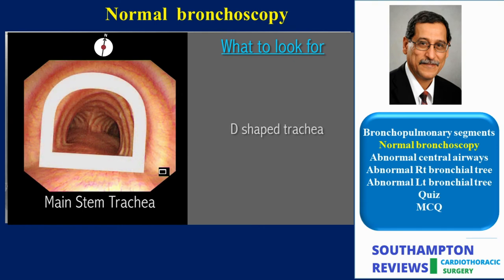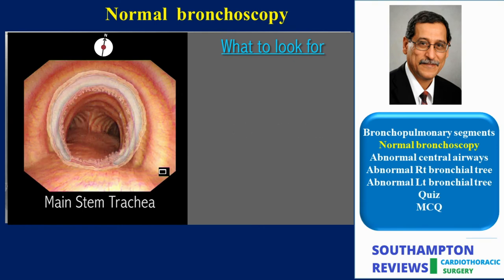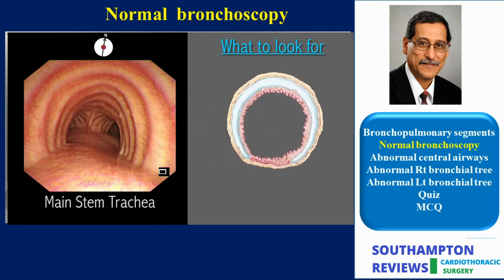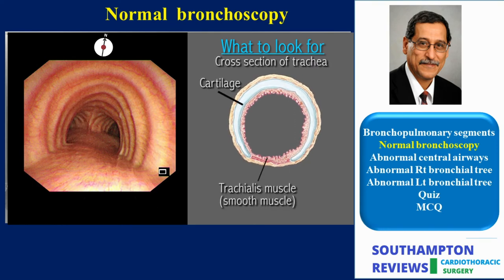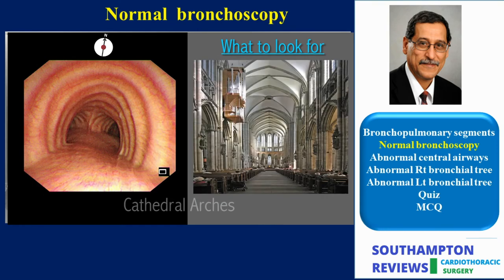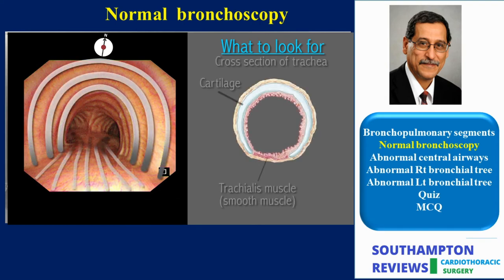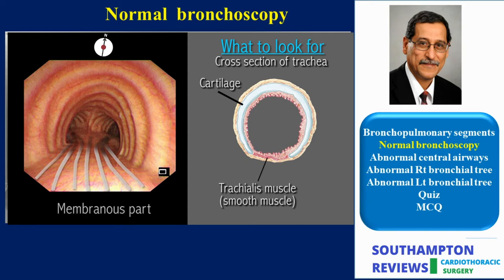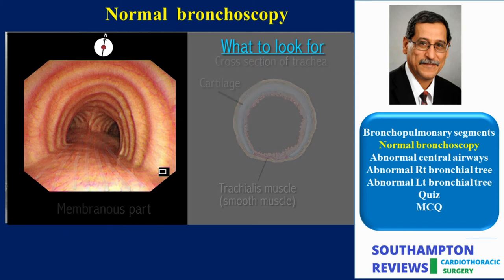The normal trachea has a D-shaped cross-section. The architecture of the scaffolding of the trachea is preserved by the C-shaped cartilages, which form what is known as the cathedral arches. The trachealis muscle forms the membranous part of the trachea and shows as longitudinal mucosal folds that make the flooring under the cathedral arches. The membranous part completes the circumference of the trachea and closes the C into a D-profile.